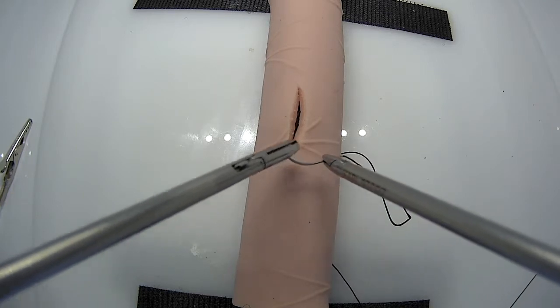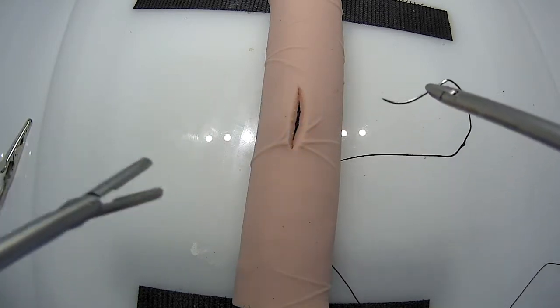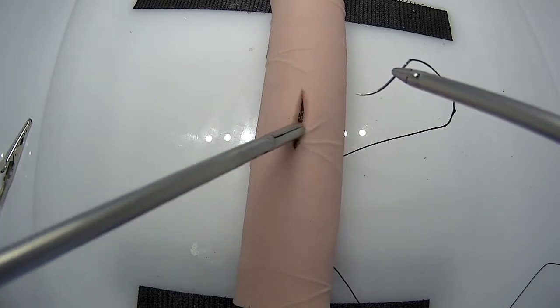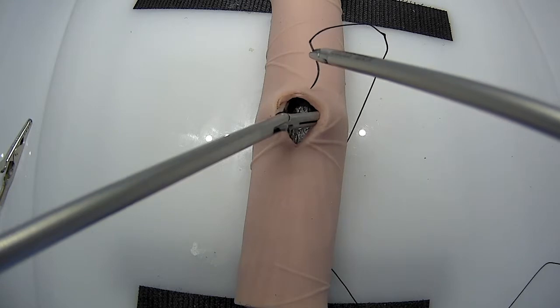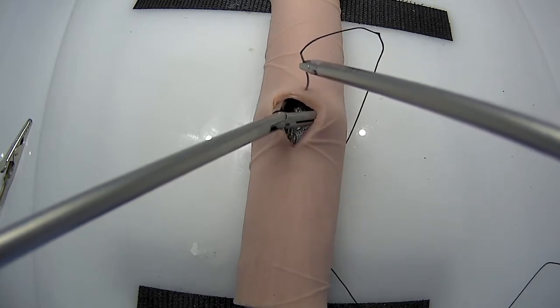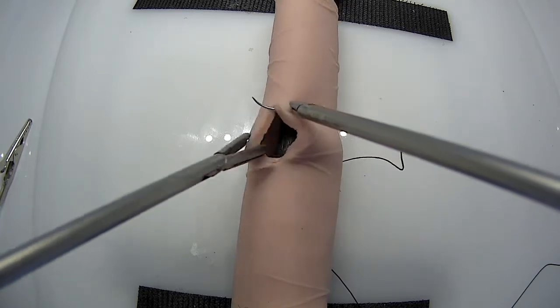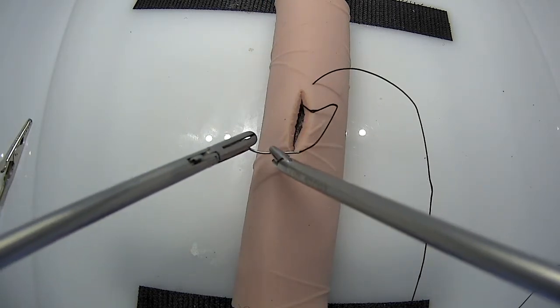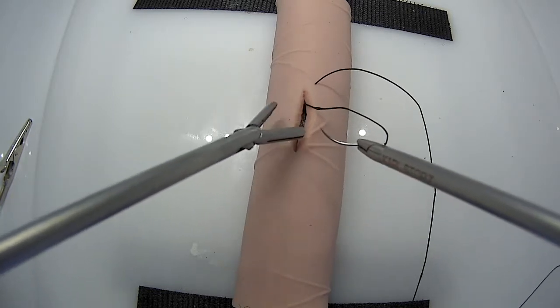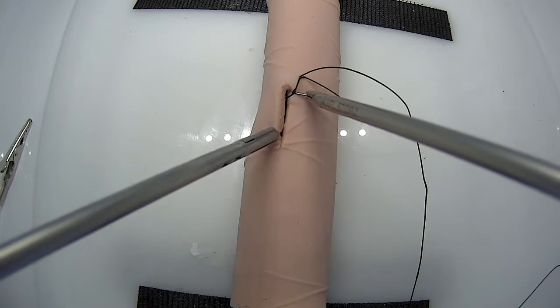Going to start at the apex of the incision here. You can use your hunter to spread the apex of the incision to show you each side. You're going to start just beyond the apex. Take a full thickness bite on both sides, making sure that you can see inside very well.